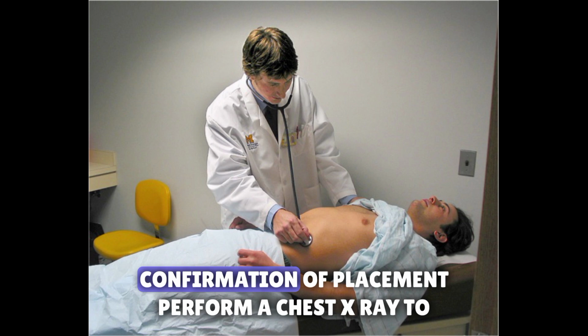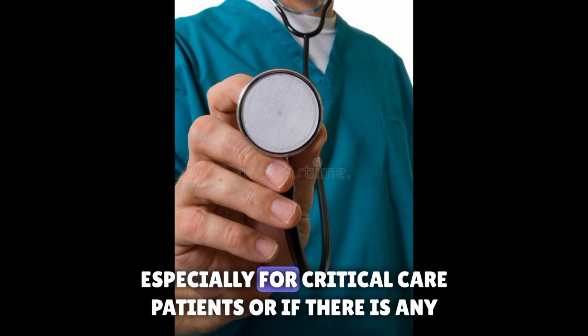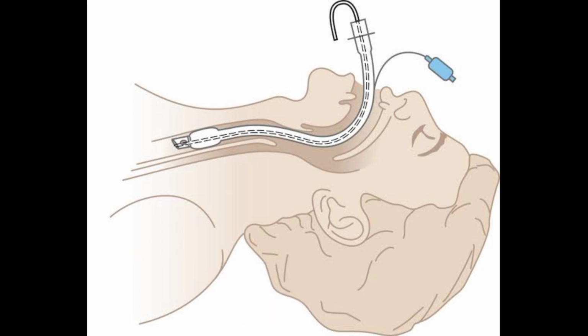5. Confirmation of placement. Perform a chest X-ray to confirm the final ETT placement, especially for critical care patients or if there is any uncertainty about tube position.